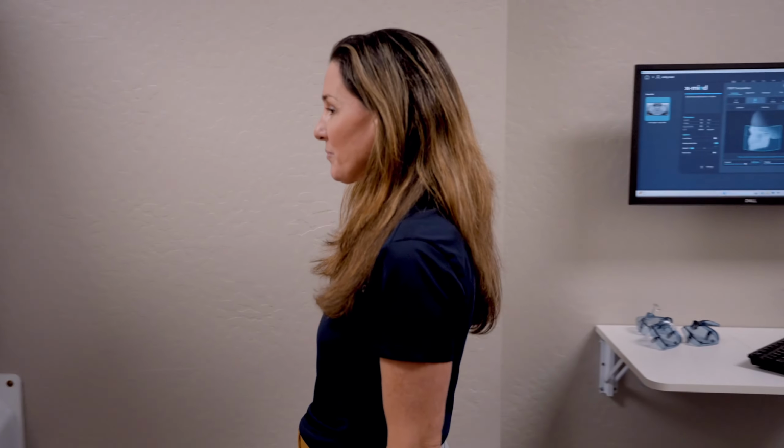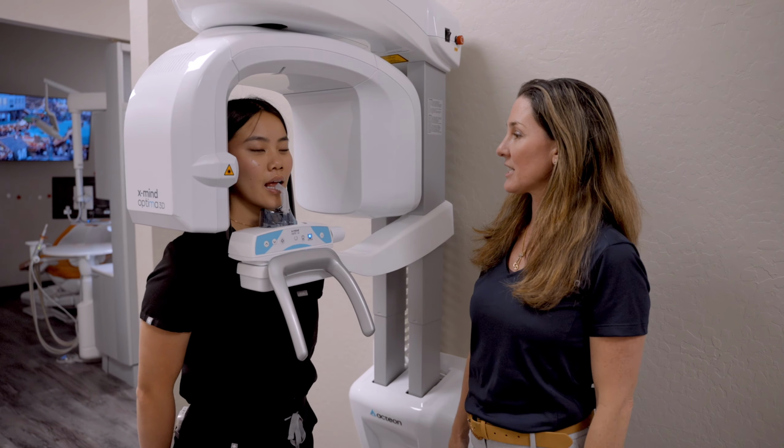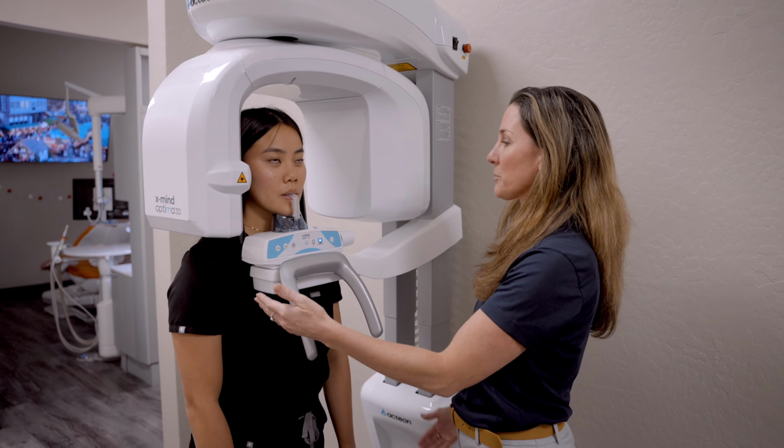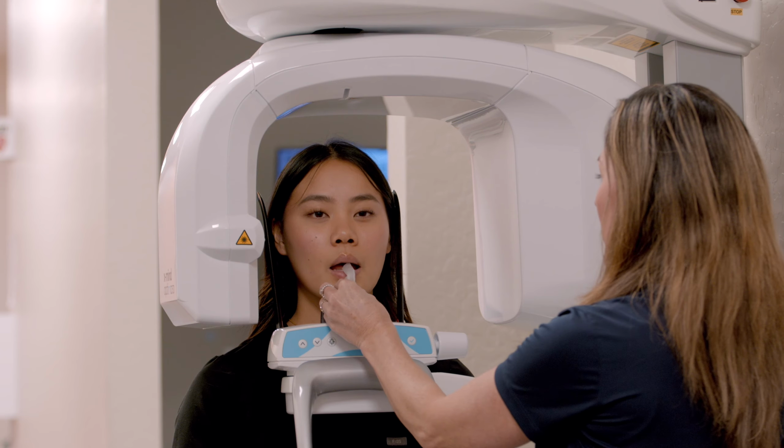So now Vicky is here for a CBCT. Again, we would want to make sure that this is at the appropriate height for her to step in. So go ahead and Vicky, let's step in. Let's have you stand nice and tall. I just want to see where you are first before go ahead and step out real quickly. Just step up nice and tall. I'm going to move that up just a little bit. Go ahead and come in. Okay, and then go ahead and put your chin down.